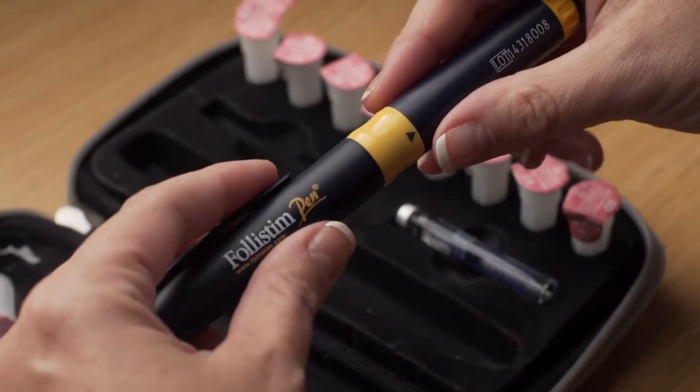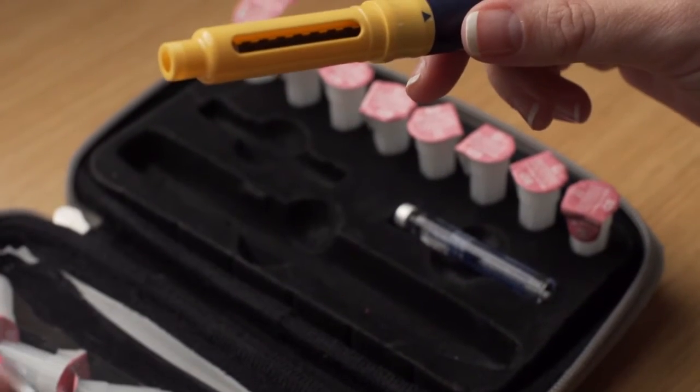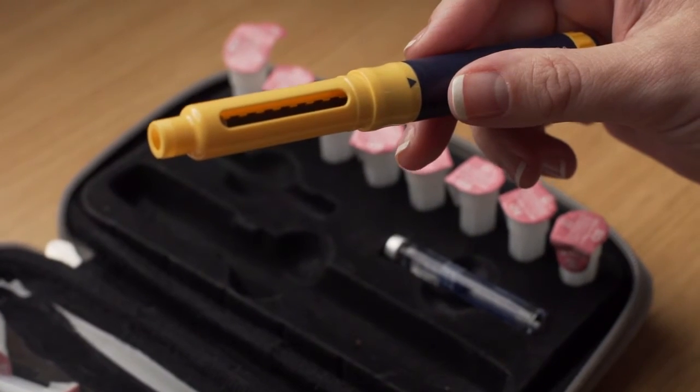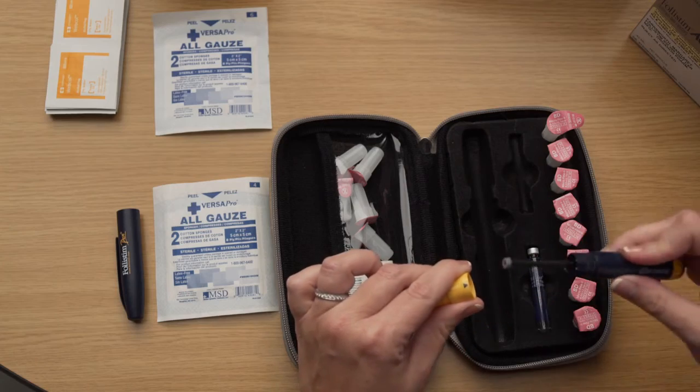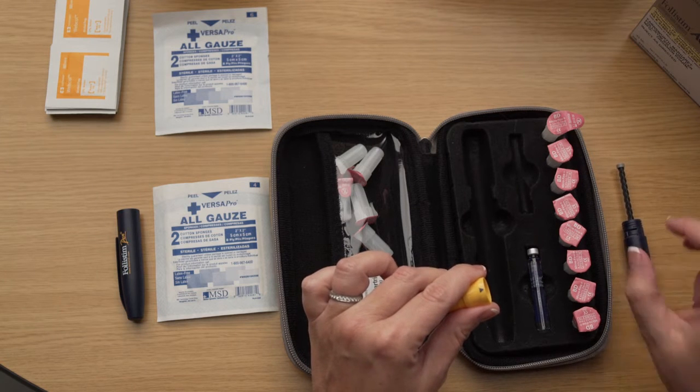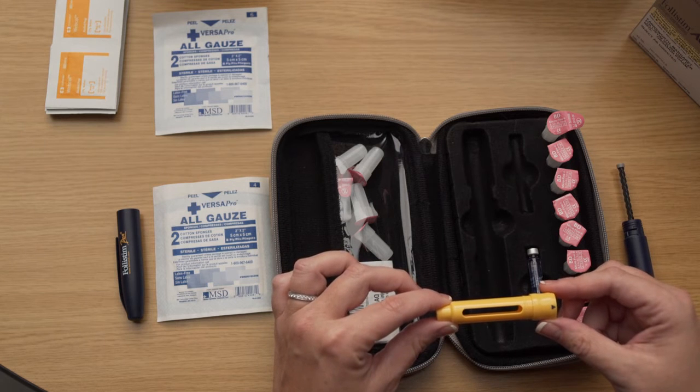Hold the pen firmly in one hand and pull off the protective cap with the other hand. The cap is the end that has a clip. Set the cap aside. The yellow and blue sections of the pen are screwed together.